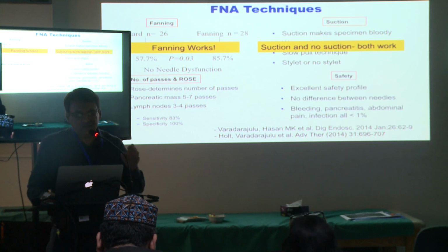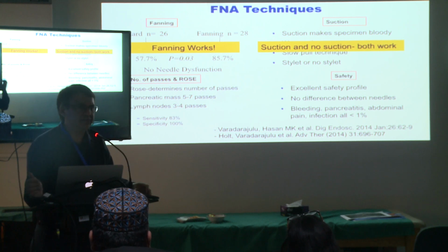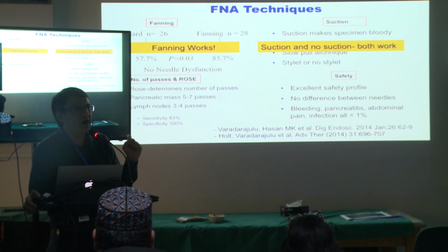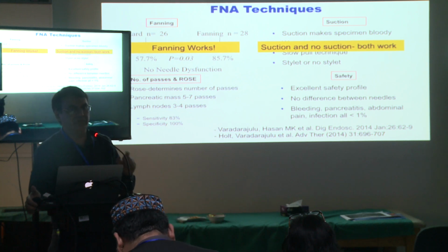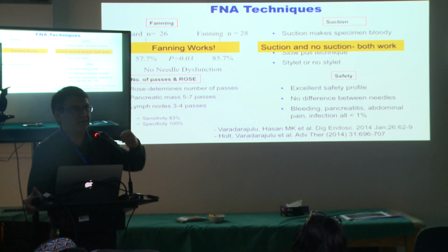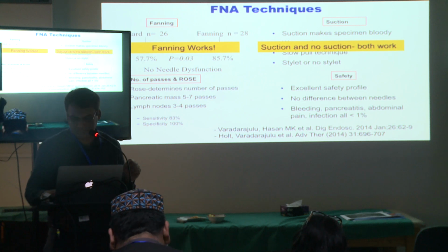Okay. Very safe procedure, excellent safety profile. Complications do happen, especially pancreatitis. Bleeding happens less often. To avoid pancreatitis, if it's a smaller lesion in the pancreas, avoid hitting the duct. Pancreatitis happens when you touch the pancreatic duct with the needle. That's when pancreatic enzymes leak, and that leads to pancreatitis. So be careful about that. If I have a choice, I would hit a small vessel, not the duct. I will avoid the duct at any cost.